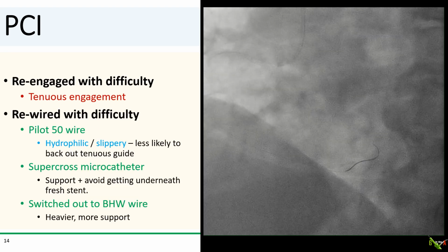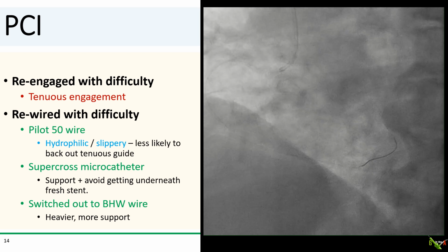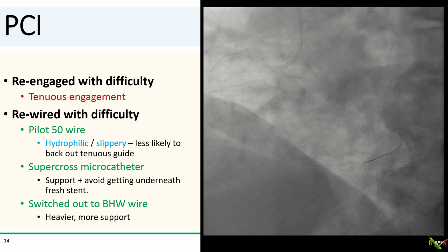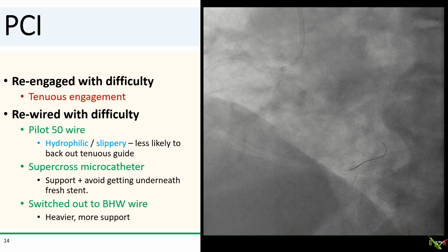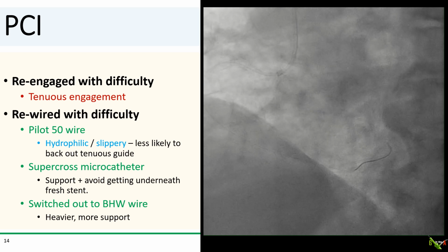So we got back into the RCA with the GR4 with a lot of difficulty. And because of the ostial stent, the engagement was very tenuous, and rewiring the RCA was not easy either. We chose to use a hydrophilic Pilot 50 wire because it's slippery. And because it's slippery, there's less friction against the wall of the tortuous RCA, and it's less likely to kick the tenuous GR4 guide back out.